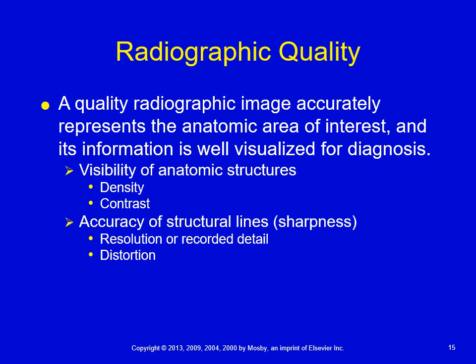All right, so when we're talking about distortion itself, some terms that you need to think about are elongation, foreshortening, and also magnification. We don't want our anatomy to be stretched out more than it should, or foreshortened more than it should, nor do we want it to be a different size or shape than it actually should, unless that is what the imaging protocol calls for.